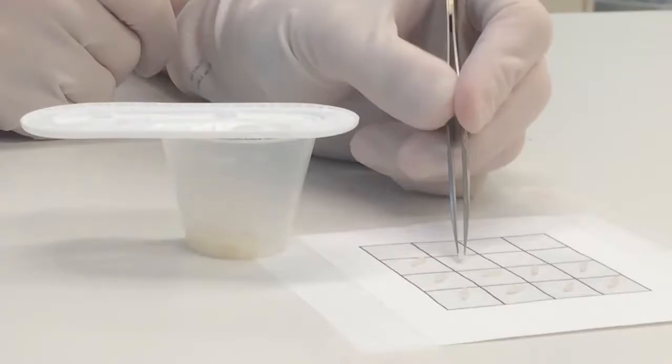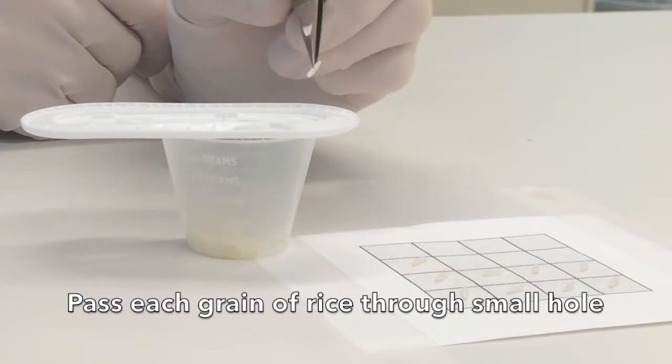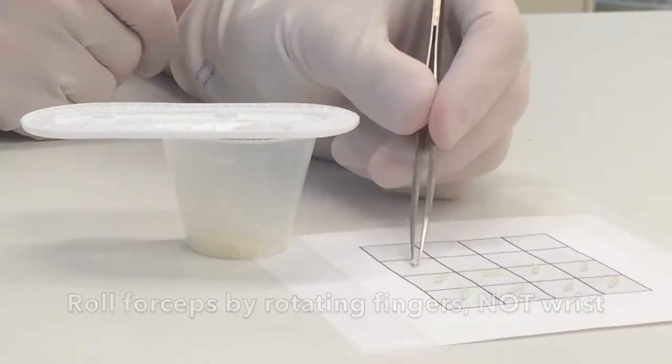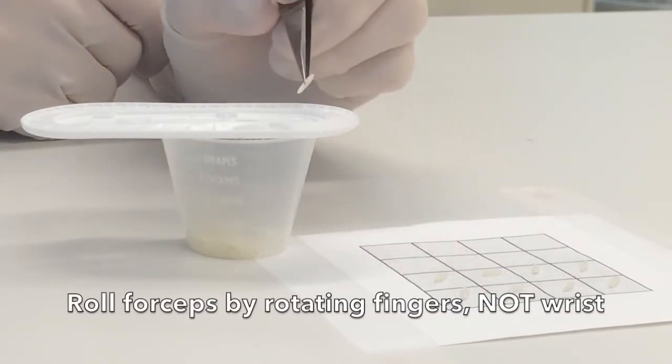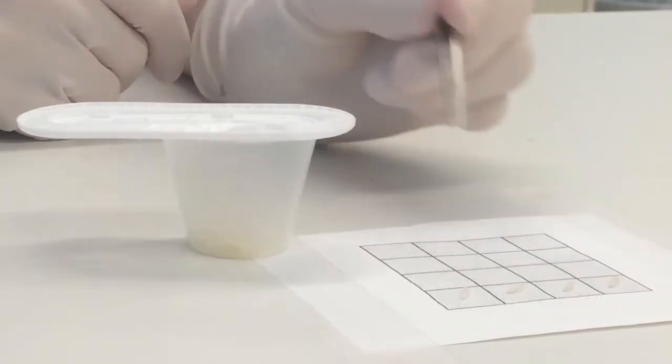Model 6 is the rice transfer via hole exercise. Using the micro forceps, pass each grain of rice through the small hole. It is important to roll the forceps by rotating the fingers, not the wrist.